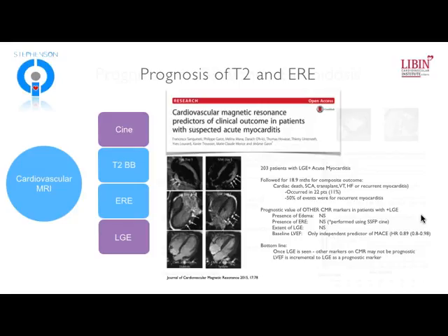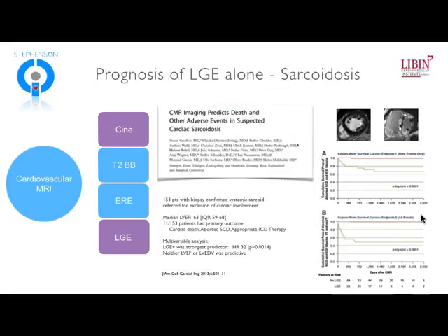It seemed that once you have acute myocarditis with LGE, there wasn't much else that was going to affect your prognosis. The only thing they were able to find in multivariate analysis was that ejection fraction did influence prognosis. And so once you have an LGE confirmed diagnosis of myocarditis, if you have a low EF, you tend to do worse. But other markers of tissue injury really didn't make any incremental difference.